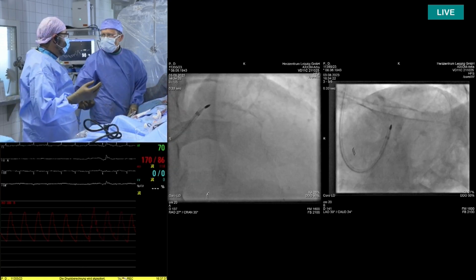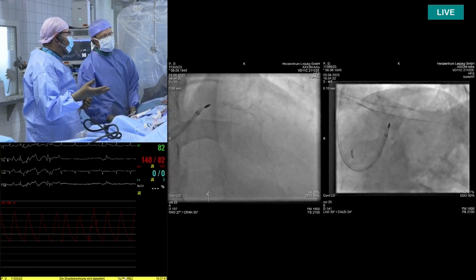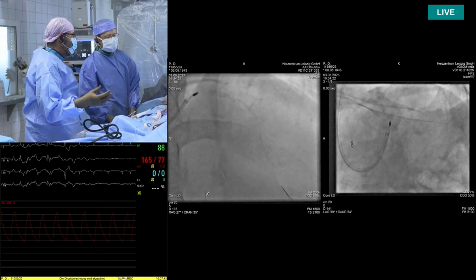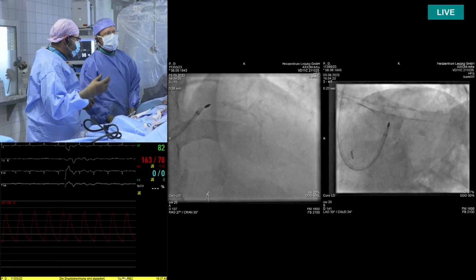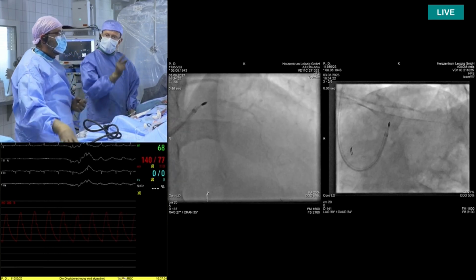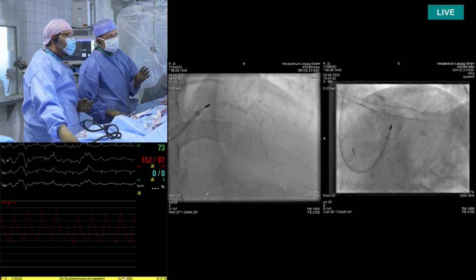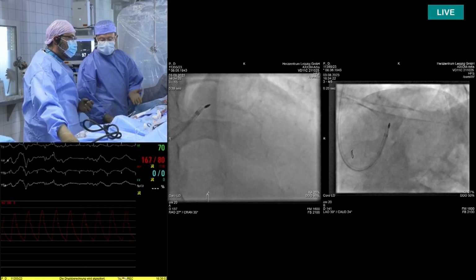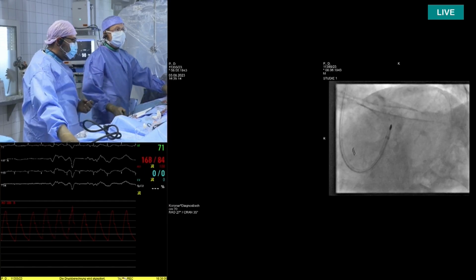If you remember, this was a very tight lesion. It's also in the left main, so you need to use IVL for a longer period of time. You could be occlusive for a longer period of time. So it would not be our favorable device. But it's also a very long lesion. We could not cover the whole lesion with one IVL balloon. We would need maybe two or three of them. And in the vast majority of cases, debulking with rotational atherectomy is actually sufficient. I will start the rotablation.